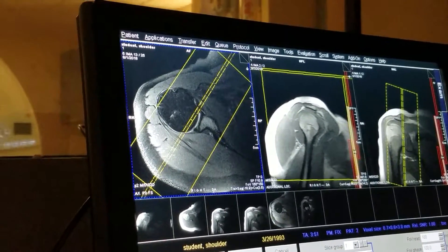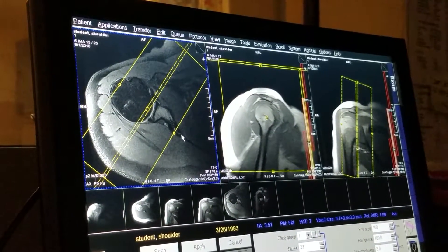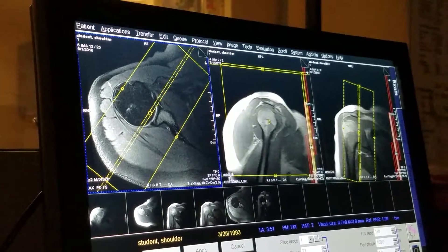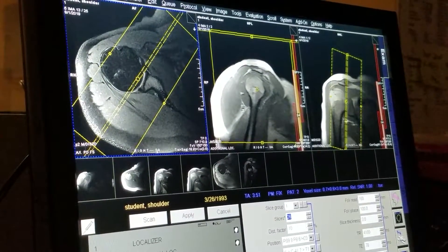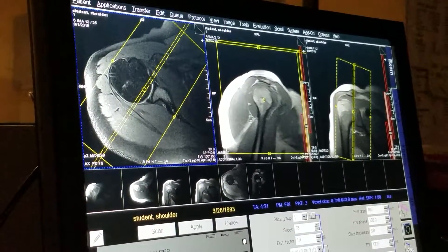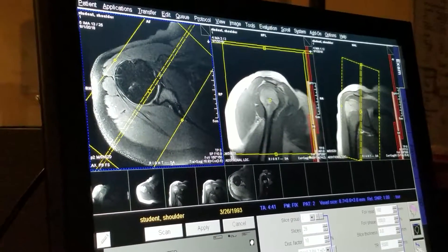So on my axial image, I want to cover from just about mid scapular spine to the deltoid muscle. You don't need to be through the entire deltoid muscle, but you want to be covering at least to the deltoid muscle. As you can see here, we need a few slices, and that should be adequate coverage.